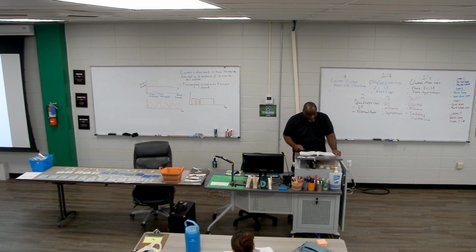Alrighty. So the book tells us under monophasic again, a monophasic pulse will have just one phase. So it's just going to have this one phase. The pulse is going to be unidirectional from the baseline, and it can either be positive or negative.